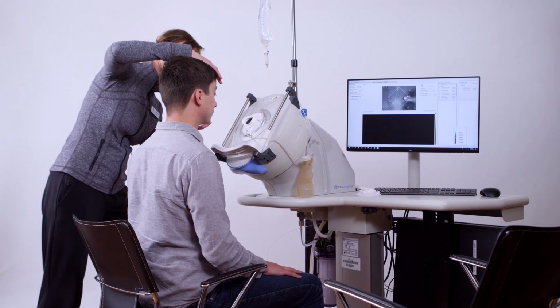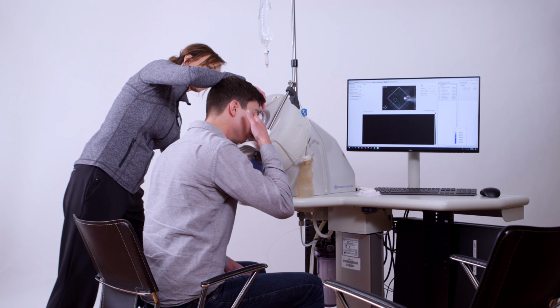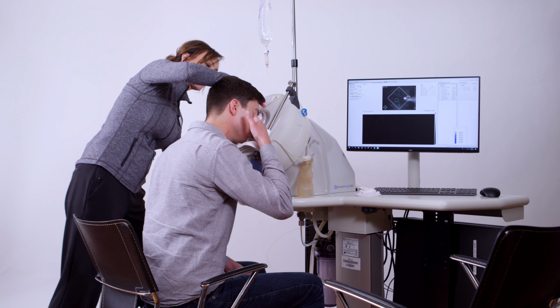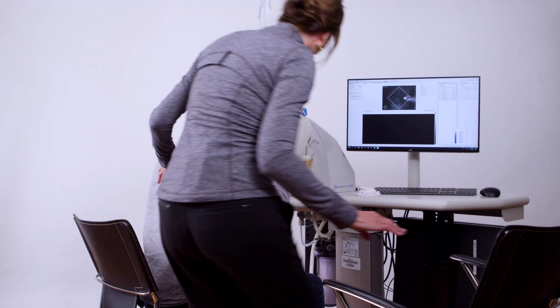The actual scan takes just seconds. We'll take several though to give the doctor many options to choose from, so your eye will be on the EyeSeal for about 5 to 6 minutes. I think you'll find it easy, though different. Just let me know if you need a break at any time.